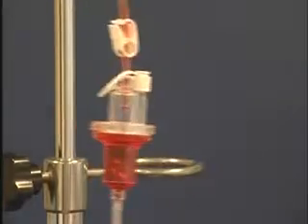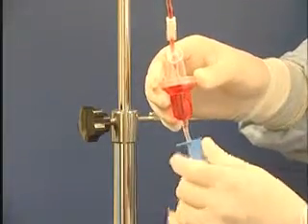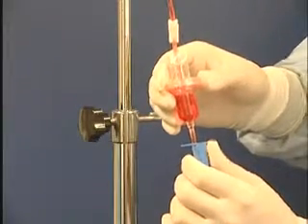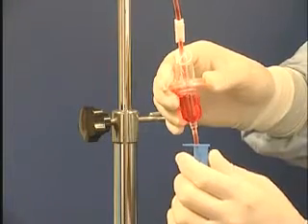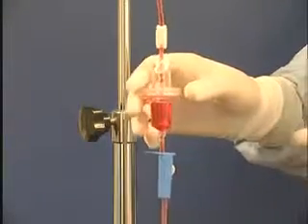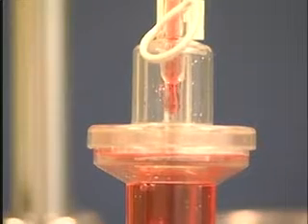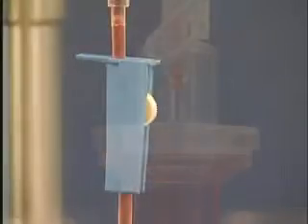We can open the roller clamp and regulate the blood flow. We make sure that the tube has been filled completely with blood before connecting it to the patient. When the donor collection vessel is empty, we stop the re-infusion by closing the roller clamp.